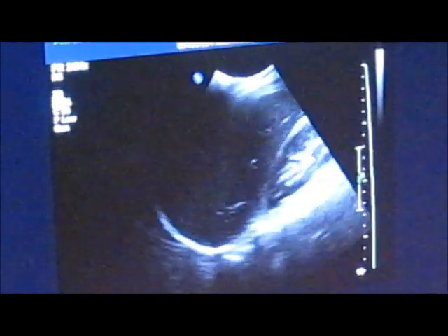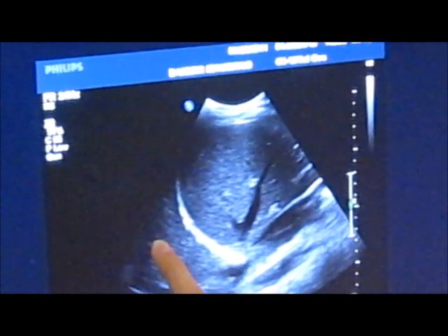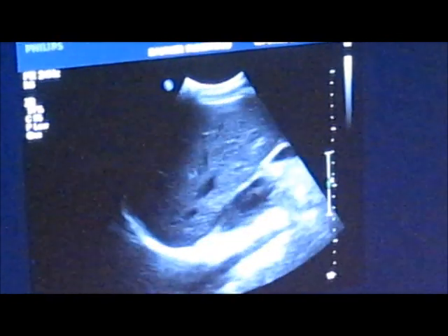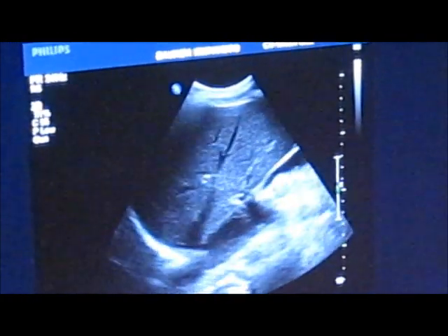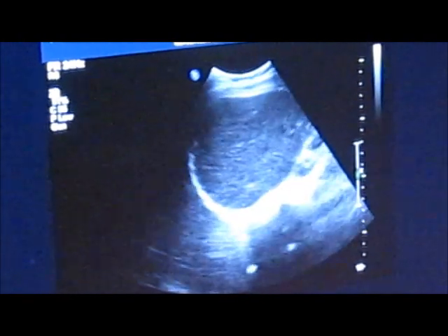Take a breath in for me. It's part of the diaphragm here, you can breathe. So we get all the way to the dome of the liver, we have the patient take a really deep breath in, and it gets all the way to the edge of the liver, and breathe.